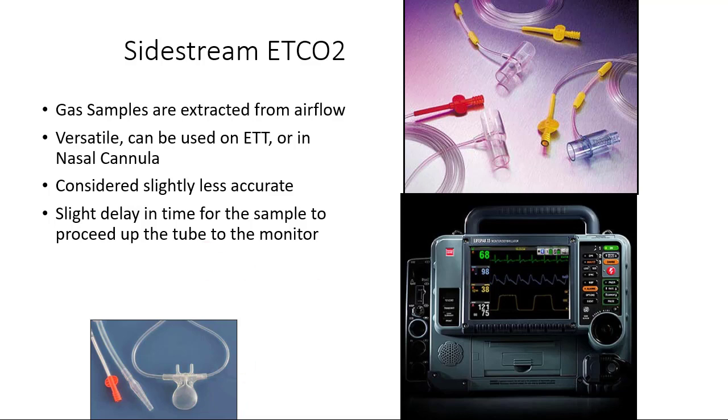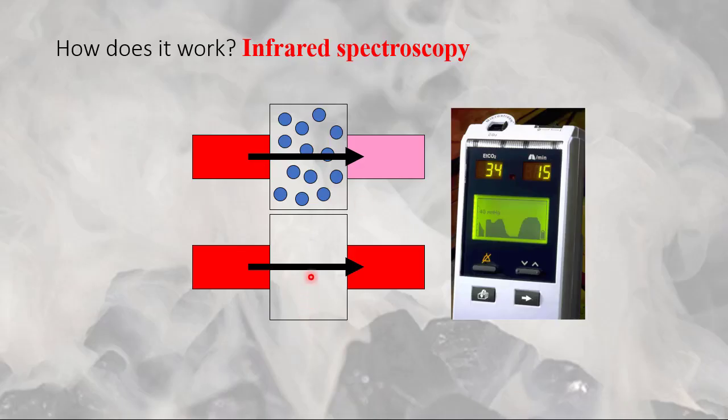So how does the technology actually work? Well, this is your simulated air tract. During inhalation, when you're pulling air in, or you're ventilating, or positive pressure is pushing air in from the atmosphere, your oxygen tank, or your ventilator, you shouldn't be pushing any CO2 in. It should be free of CO2. So when the infrared light is shining across, it shows nothing. This is your baseline.